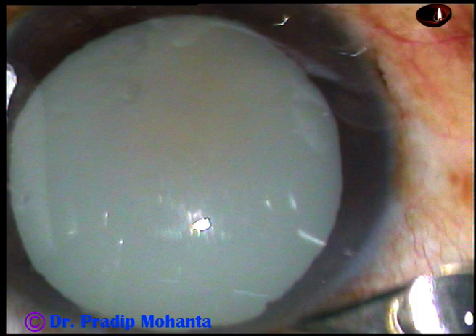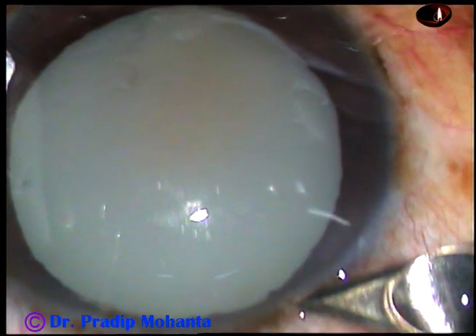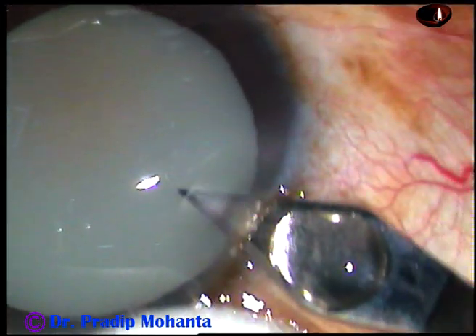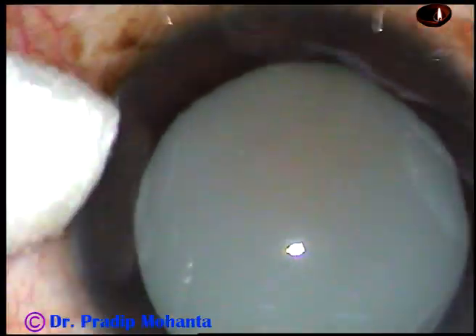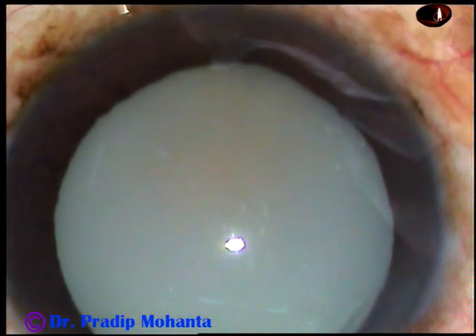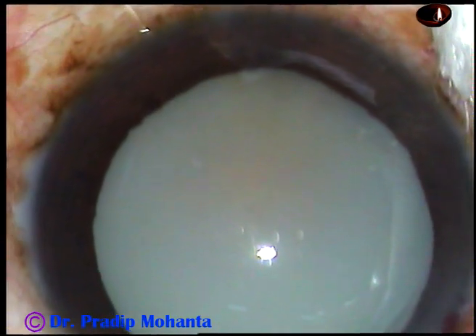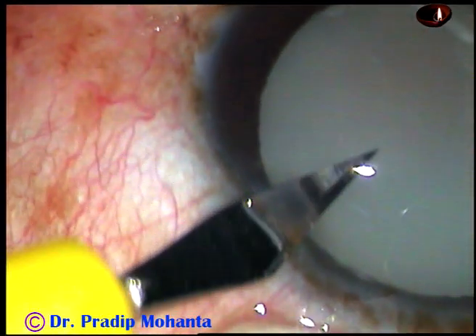Friends, let us observe management of this hypermature Morgagnian cataract. This is the main incision with a 2.8 mm steel keratome. And now on the left side of the main incision, about 3 o'clock hours away, this is a side port.